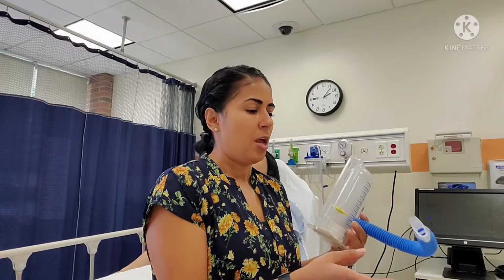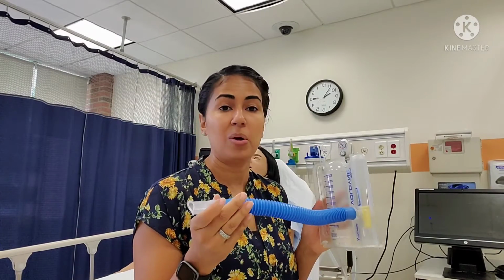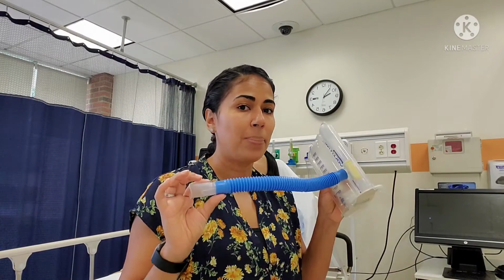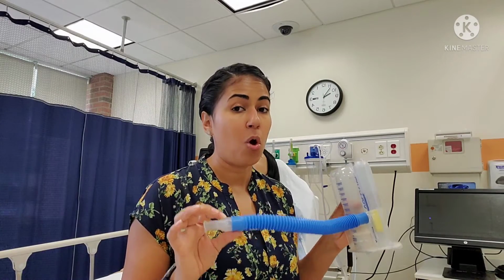Make it like a game, make it a challenge to encourage them, because this is something where we can see progress as we're getting better, right? And what happens many times is that they blow into it, and they're just becoming blue in the face trying to blow into this. If you think about the fact that we're trying to expand the lungs, blowing into this is not going to help. What we want to do is take a nice big deep breath in.